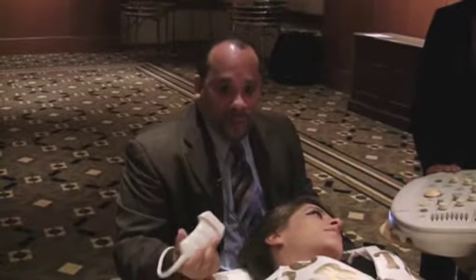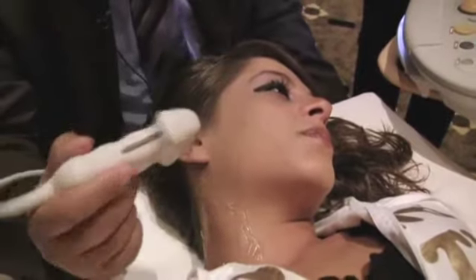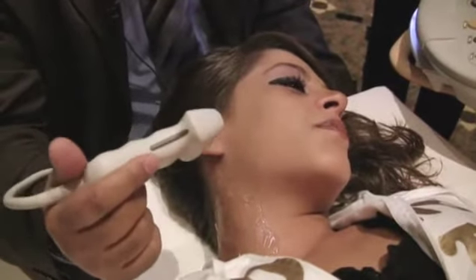I'm also a fellow for the Society of Vascular Ultrasound, and today I'm going to be going over carotid artery ultrasound techniques and some pitfalls and pearls and other techniques to help guide you through the performance of carotid artery ultrasound. So let's get started. Here, we're using an L9 transducer, really the workhorse for carotid artery testing.